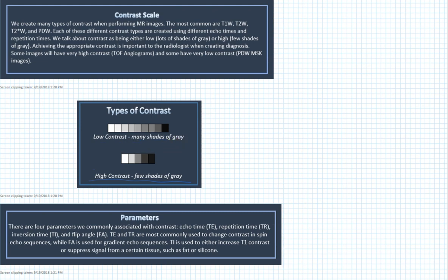We're going to talk about how it's the difference in color between two pixels. So if we have two different pixels that we're looking at, and one is very dark, we could say it's black, and the other has white, then this is a contrast. It's the difference in shade between these two, the difference in color, you could say, but it's black and white. So it's the difference in shade between these two different pixels. That's what contrast truly is.